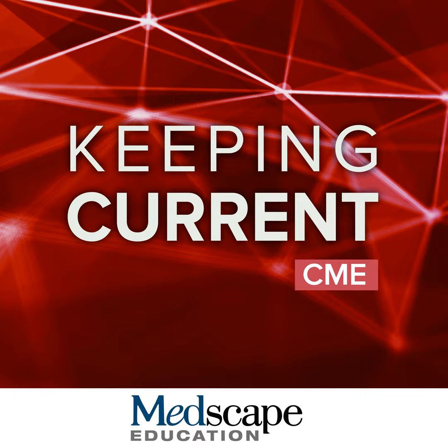Now, let's come back to this question about amyloid and tau PET in the setting of amyloid therapy. Eligibility at the beginning, as well as the follow-up to the therapy. And in both cases, for the amyloid PET, having the quantification is very, very helpful, especially if you're trying to assess that response. It's nice to know the quantification before and after. Tau PET may also be helpful in that stage of eligibility. And again, this comes out of those lecanemab and donanemab trials.